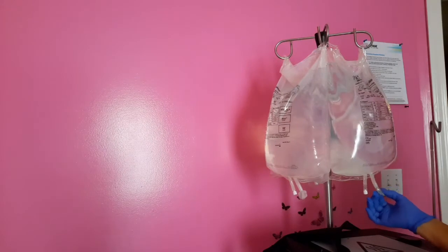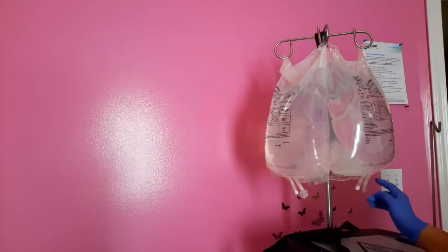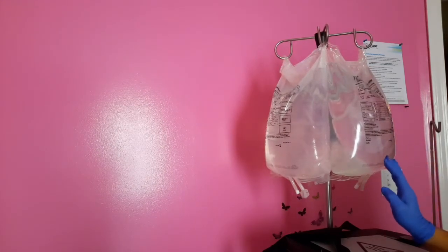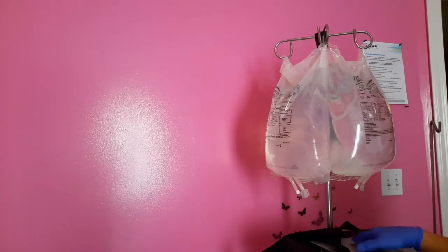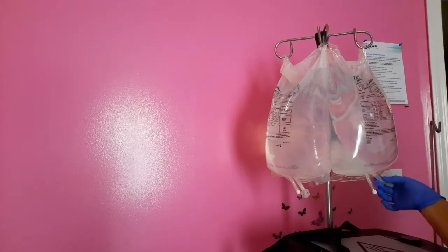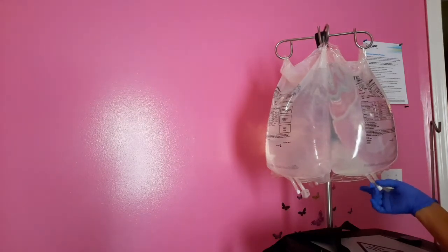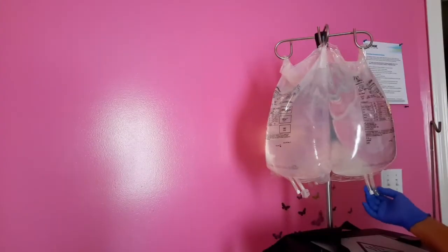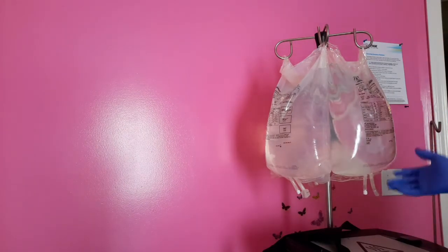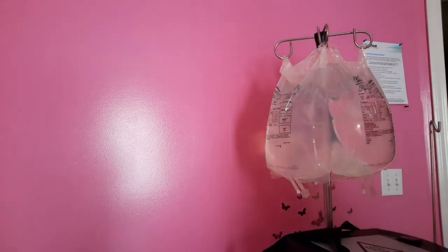The reason for the wings on every bag, even though we're not going to use them on the ones hanging, is because the fourth bag is going to be on the warmer, and that one we do use the wing and the cap ports on to attach lines. One for the multi-line adapter and this one for the dialysate line. That's why they all have the wings, even though you don't always use them all. One bag, and we don't know which one, will always end up on the warmer, and those will be used.